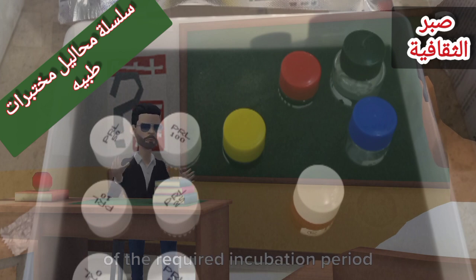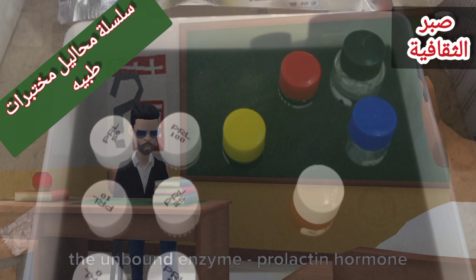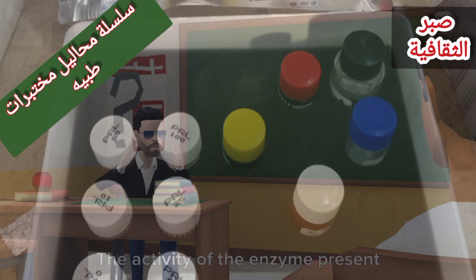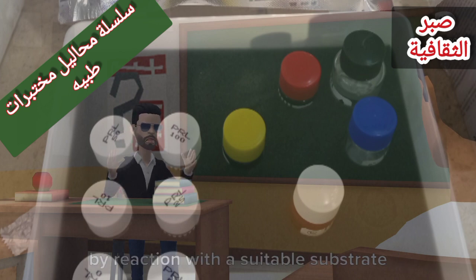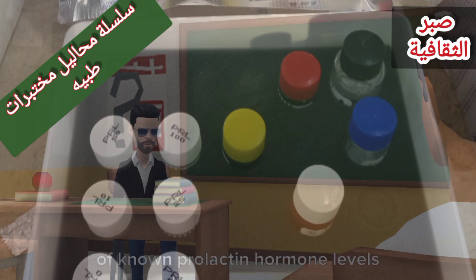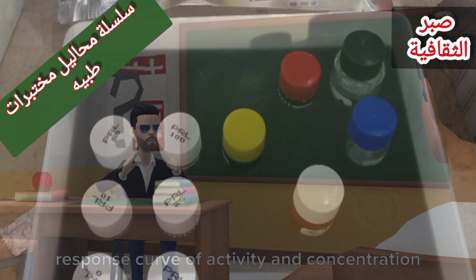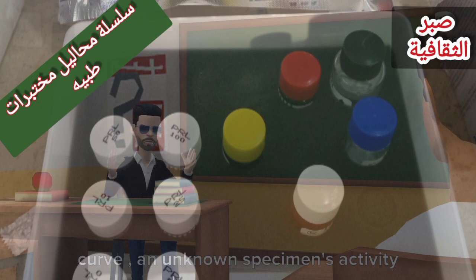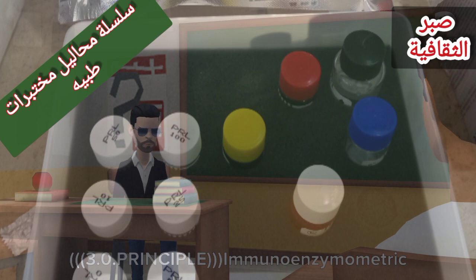the well. After the completion of the required incubation period, the enzyme-prolactin hormone antibody-bound conjugate is separated from the unbound enzyme-prolactin hormone conjugate by aspiration or decantation. The activity of the enzyme present on the surface of the well is quantitated by reaction with a suitable substrate to produce color. The employment of several serum references of known prolactin hormone levels permits the construction of a dose-response curve of activity and concentration. From comparison to the dose-response curve, an unknown specimen's activity can be correlated with prolactin hormone concentration.